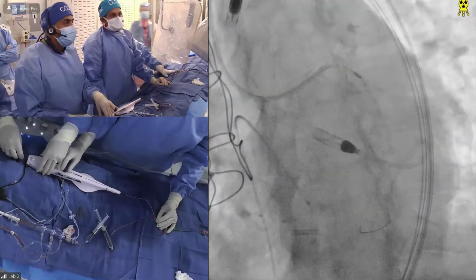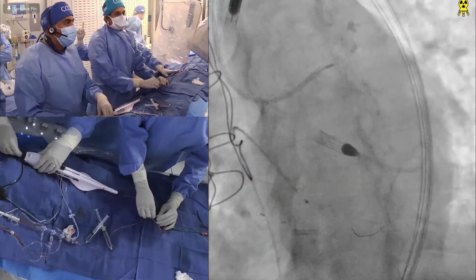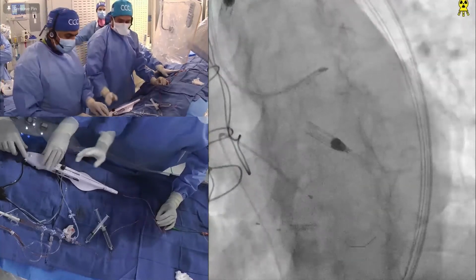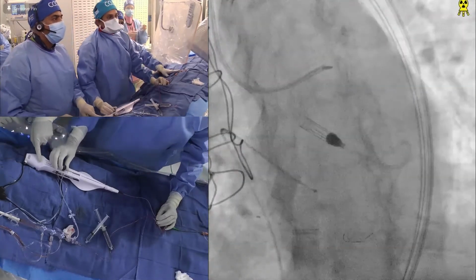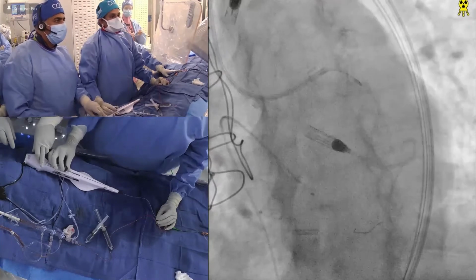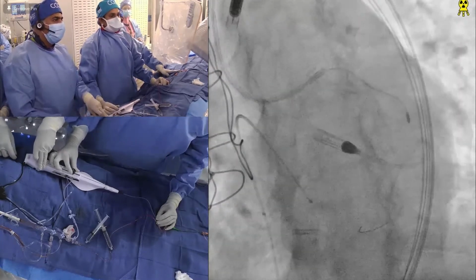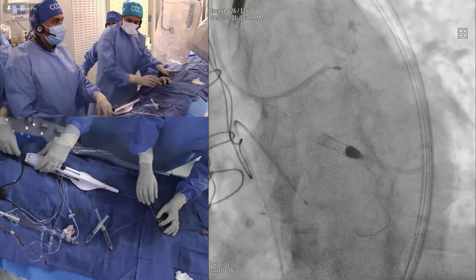Okay. LV is about 40 to 45%, but he presented with heart failure, so diastolic dysfunction. Today also the EDP was 24. So it does have a component, both systolic and diastolic, but truly it's not a classical 35% EF. Okay, ready? Yep.